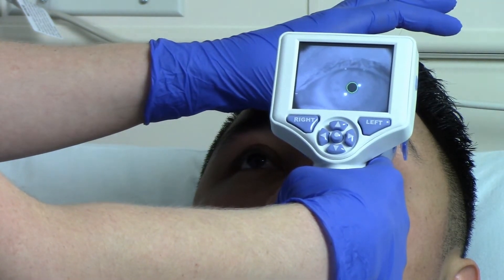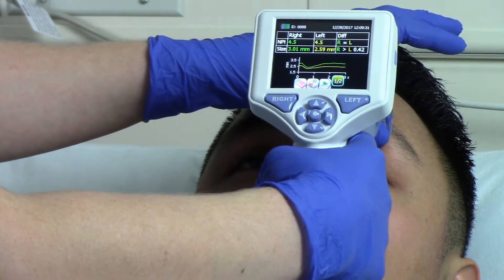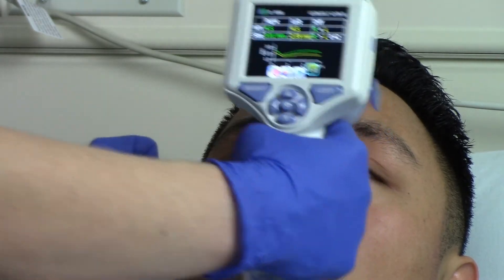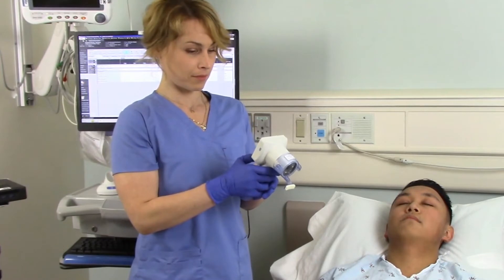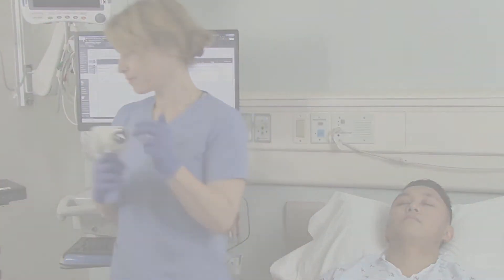The most effective way to use the Pupilometer is to establish the earliest possible baseline measurement with the first neurological exam when the patient is admitted into the ICU, the emergency department, or the post-anesthesia care unit, and then trend for changes over time following standard pupil assessment protocol.